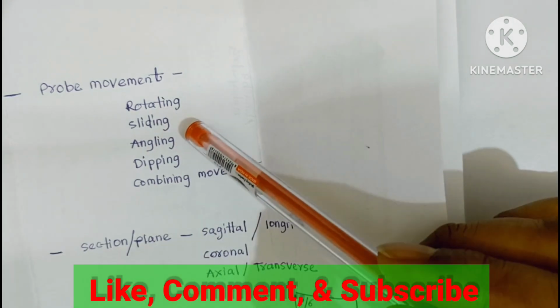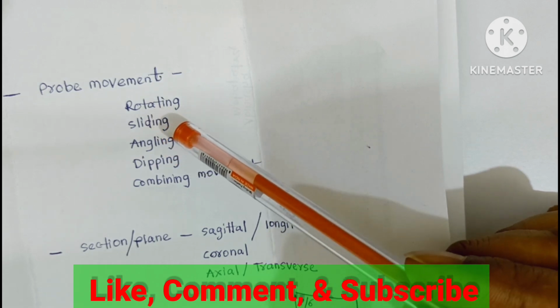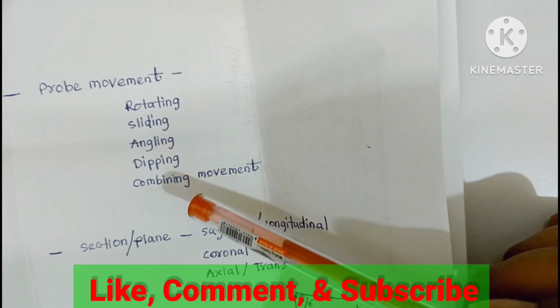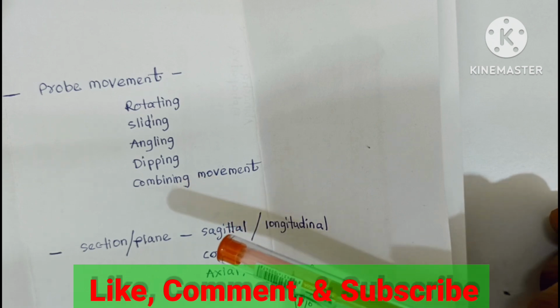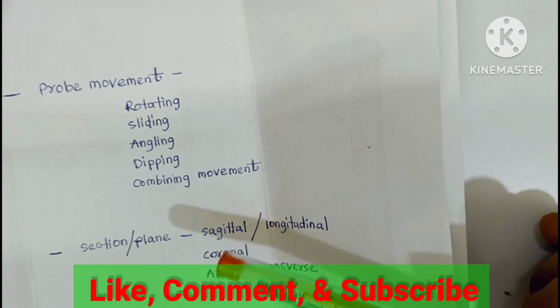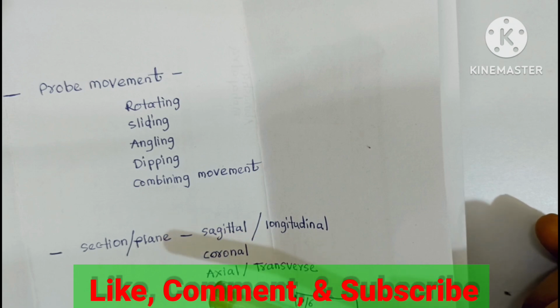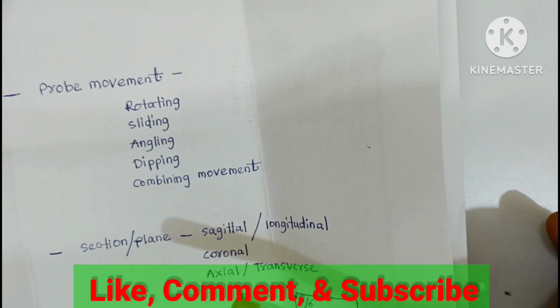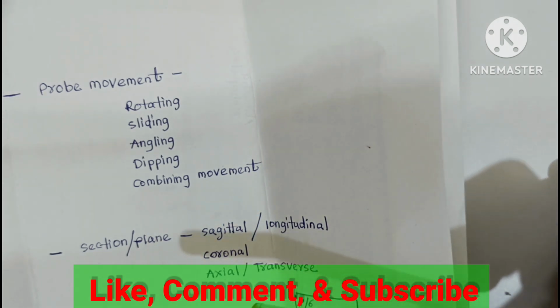What is the meaning of sliding movement? During sliding movement, you should keep your probe perpendicular to the abdominal wall, and your movement should be slow and steady. Sliding movement has two types: when we slide along the narrow axis, and when we slide along the broad axis.